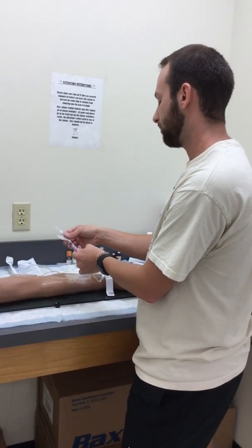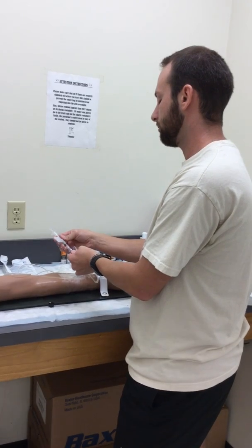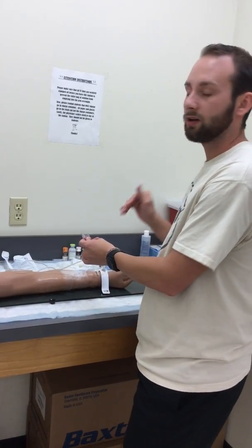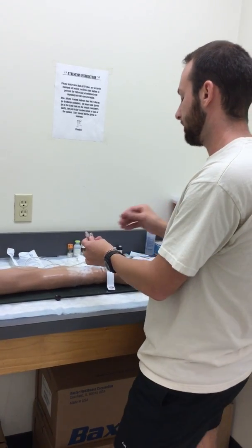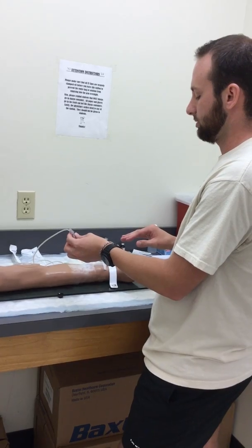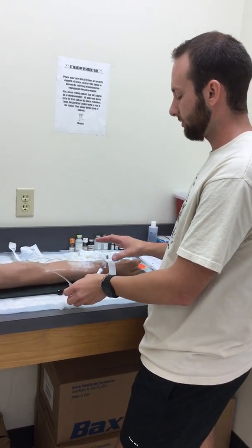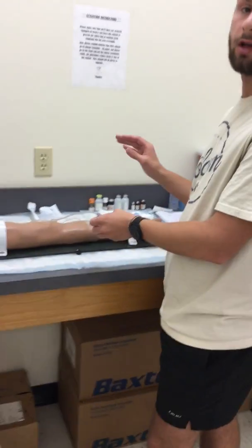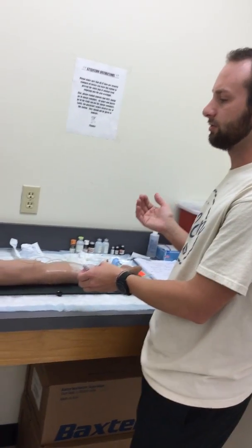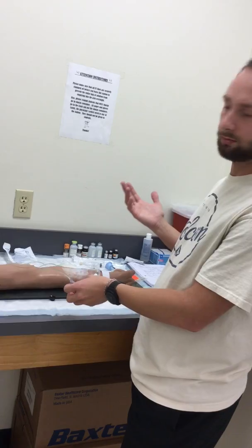So after that, we would want to just unplug it after you're done. And since it was compatible, we did not have to flush before. And so now that we have that done, we're just going to want to make sure that it is still a patent IV. We're going to want to monitor our patient, monitor their heart rate and their blood pressure, and make sure that they're still breathing.